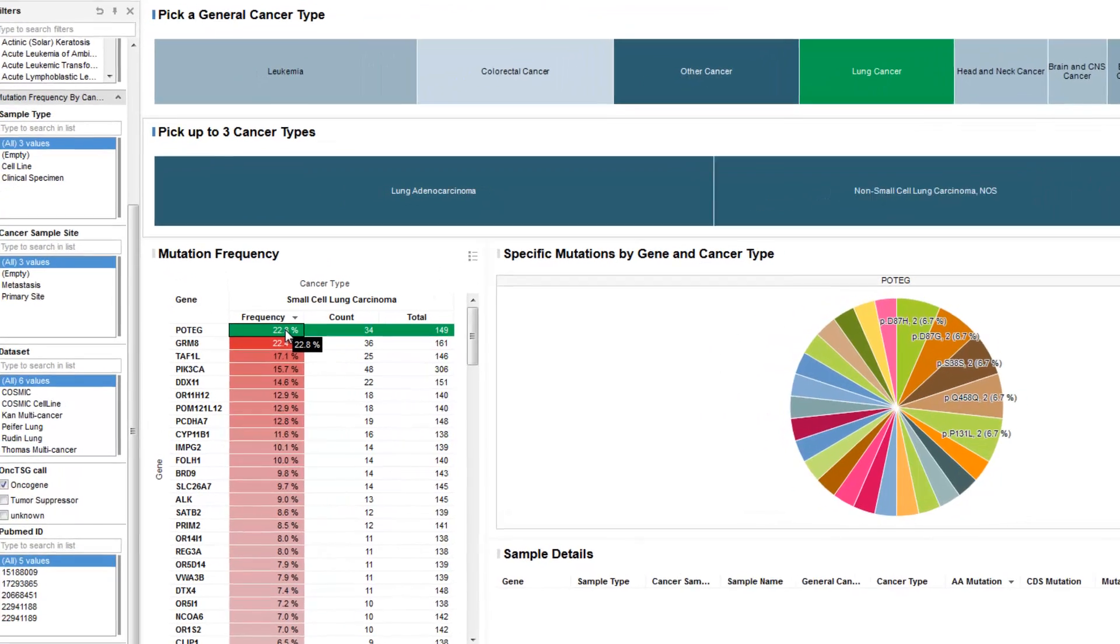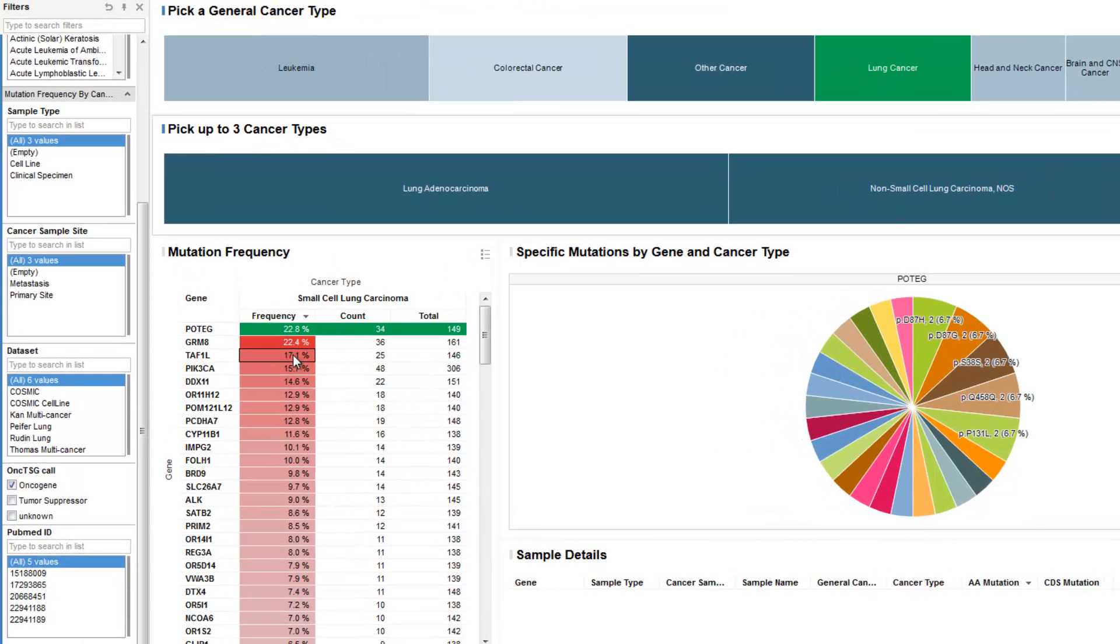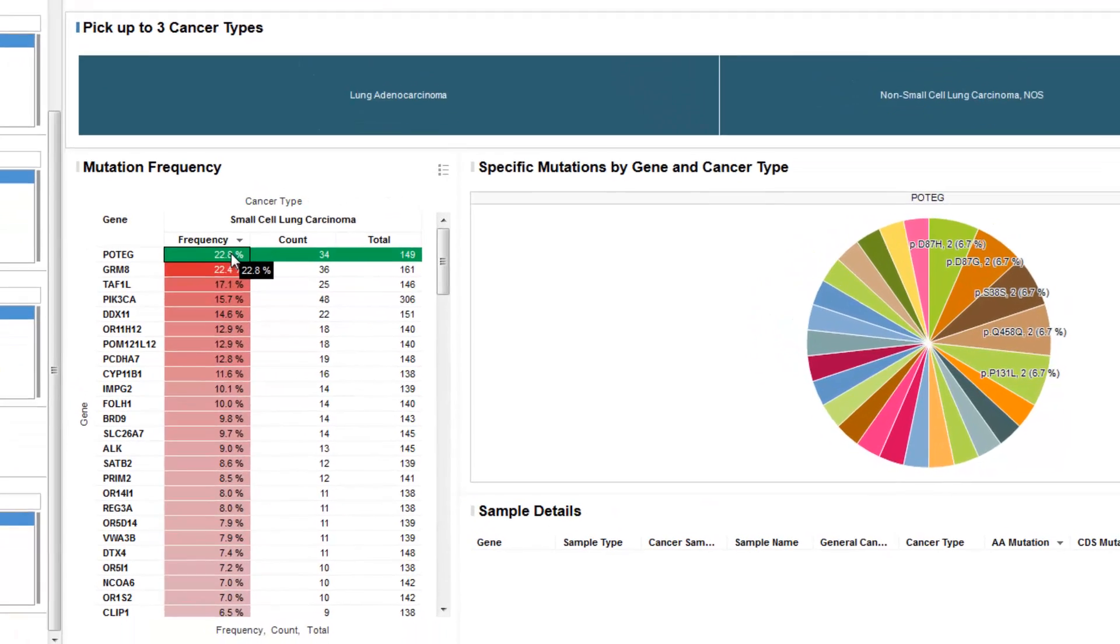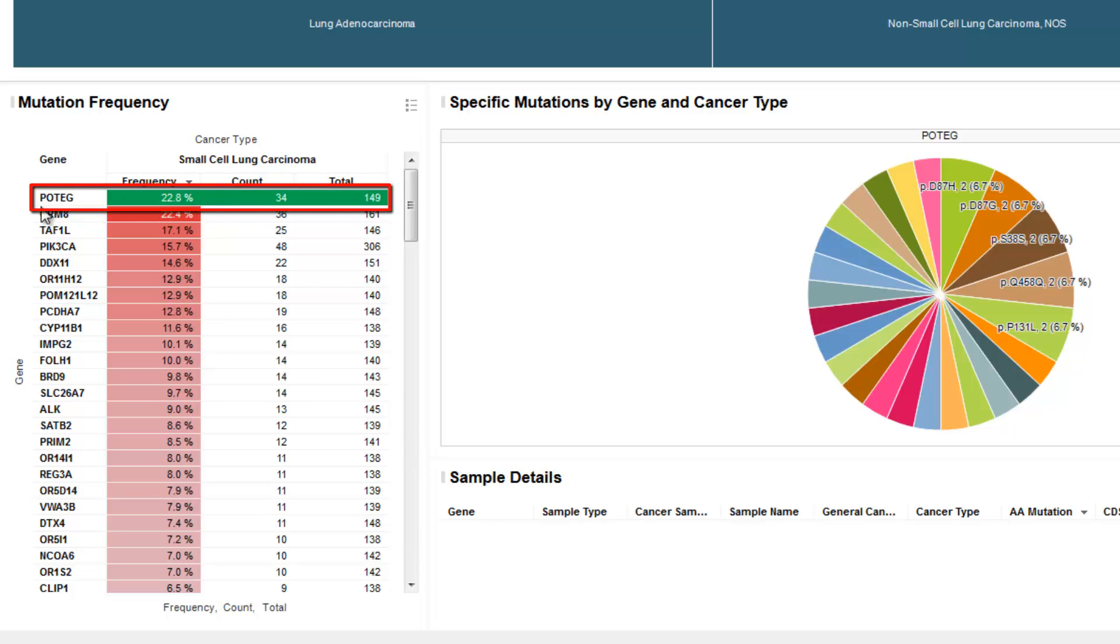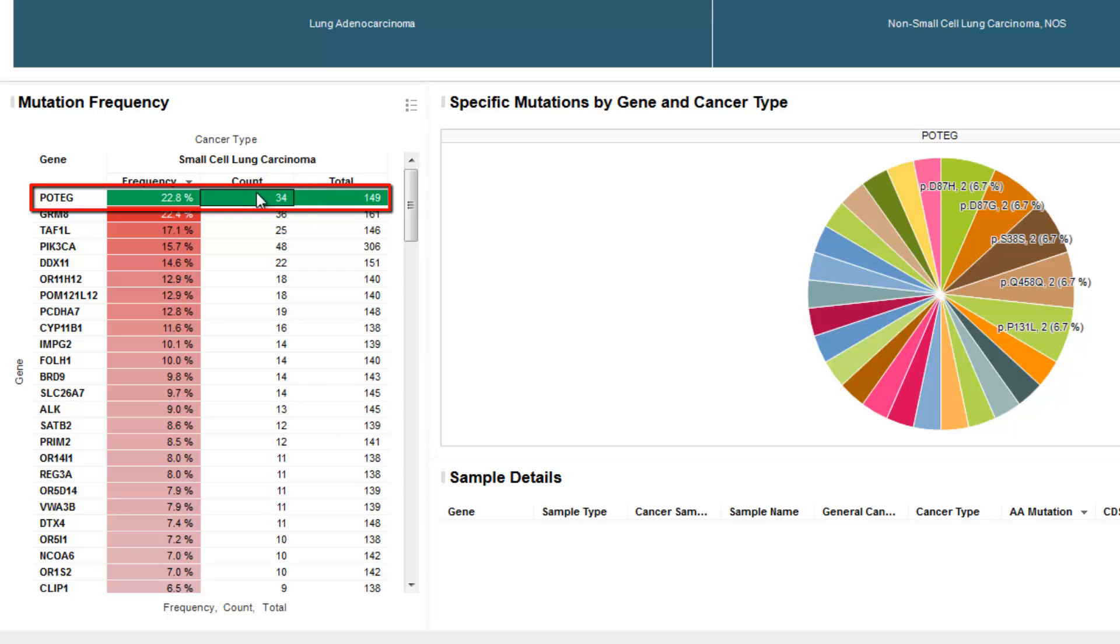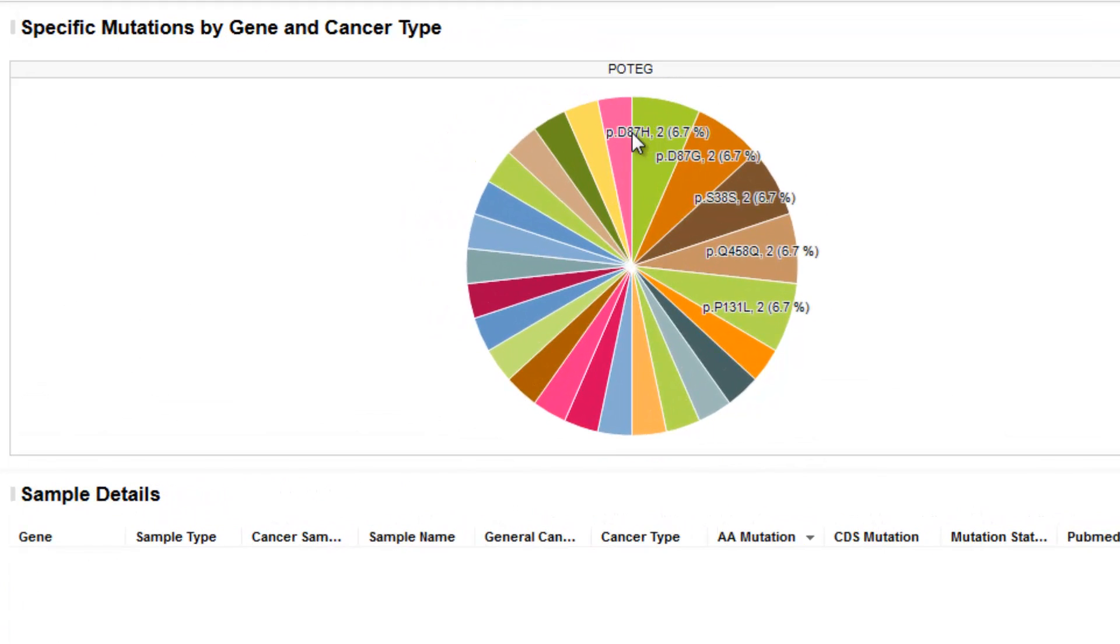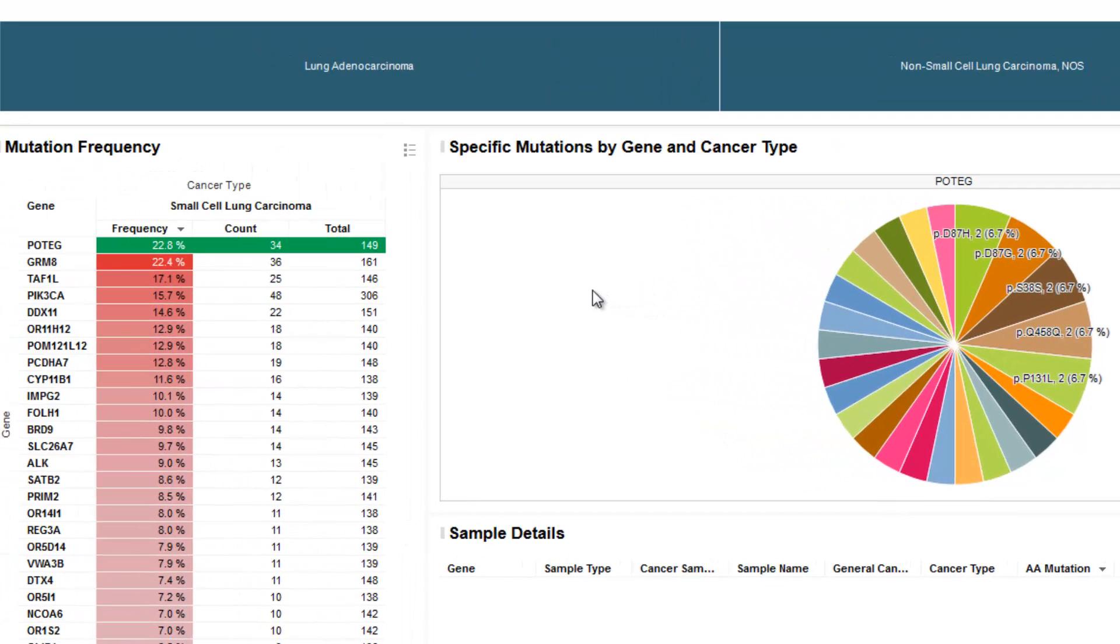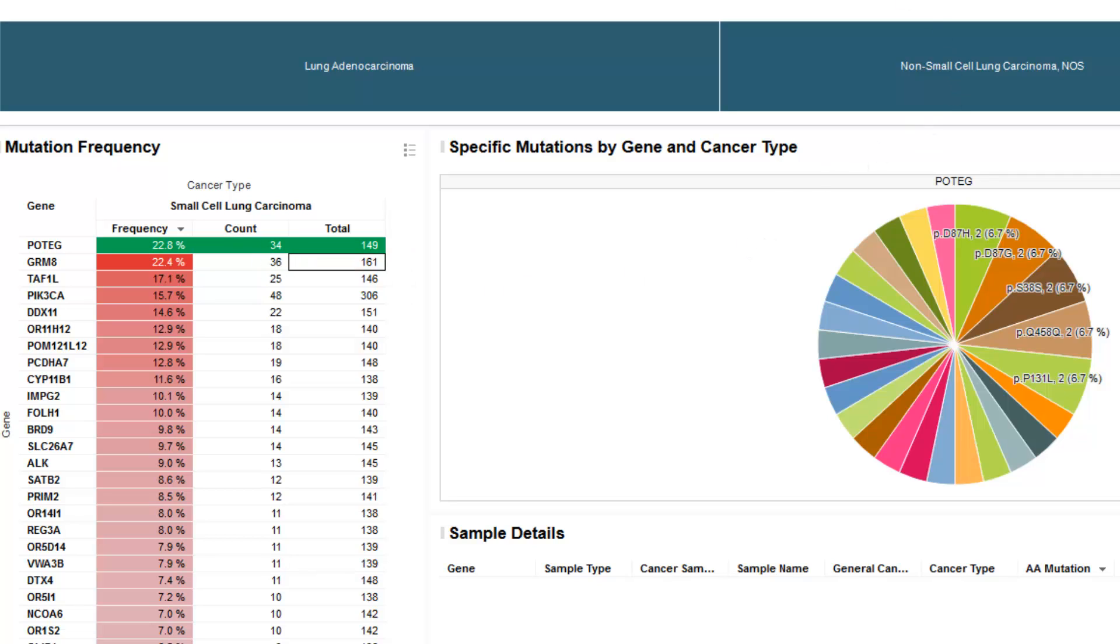In this discovery workflow, we now have a prioritized list of targets where there are mutations in small cell lung carcinoma. We've also applied a filter to identify those that are potential oncogenes based on recurrent mutations at hotspot locations across the protein. Here, we see POTEG at a frequency of 22.8%. 34 patients out of 149 total were tested for mutation in this gene. And in the pie chart to the right, we see the specific mutations being summarized, and note the 87 amino acid position where there are a change from D to H or D to G. This being the hotspot that is being summarized and calling this as a potential oncogene. This discovery workflow allows one to investigate a number of new potential targets.